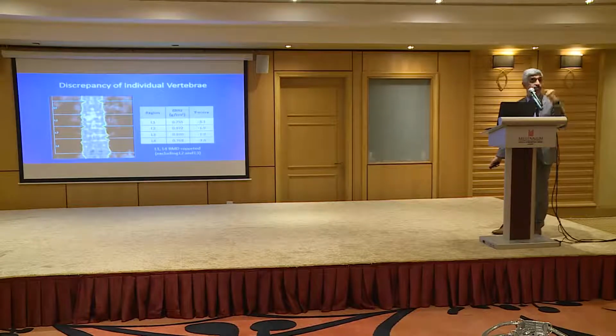This one, on the other hand, is different. L1 looks like L4. L2 looks like L3. So what do we do? We look at the image. L2 has a high density, right? There's something wrong here, and maybe a little bit something wrong at these areas. So this is probably someone who would have arthritic changes, and this is how they will look. They will have higher density, and the height of the spine will still be normal. Unless you see that the spine actually flattens and becomes shrunken with the higher density, then this is most likely a hidden fracture, okay?